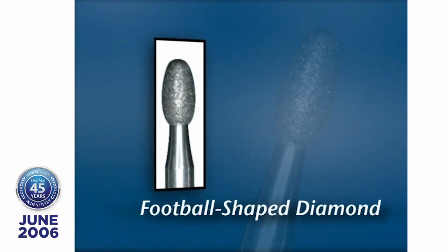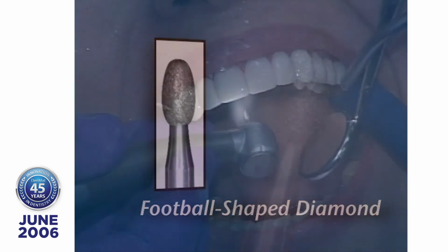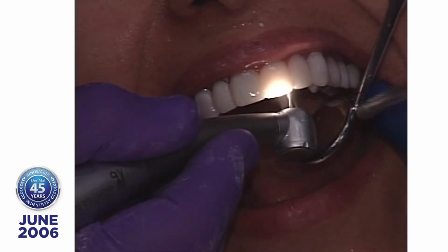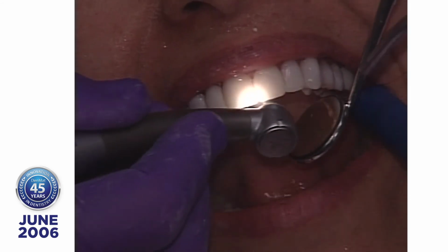Now we'll go to the football-shaped diamond. All of these little instruments are in one kit called a finishing kit. I used to call them off, and somebody said, why can't you just put them all in a kit? And so we did call the Lumineers finishing kit.